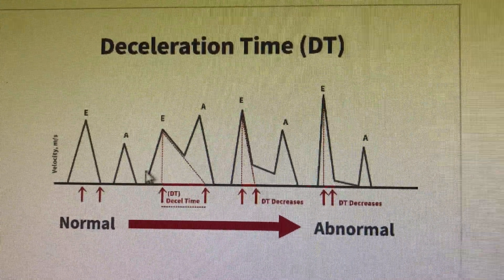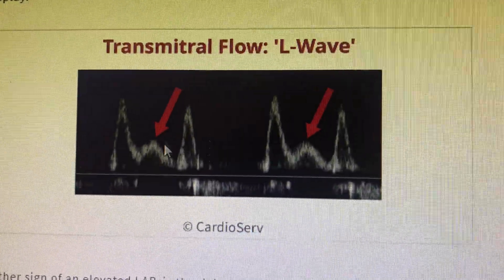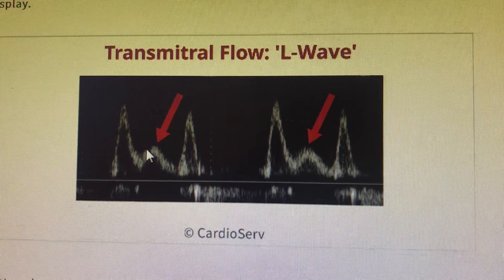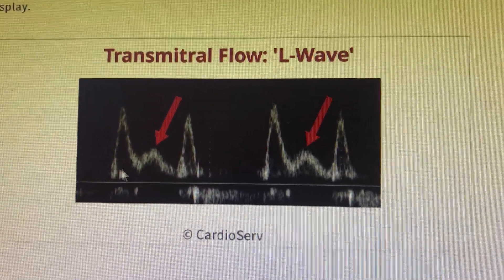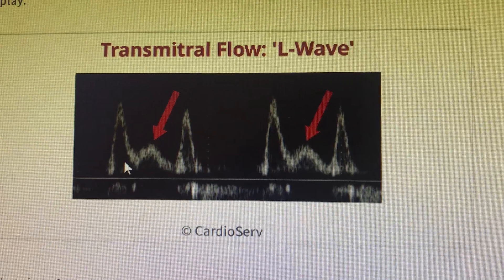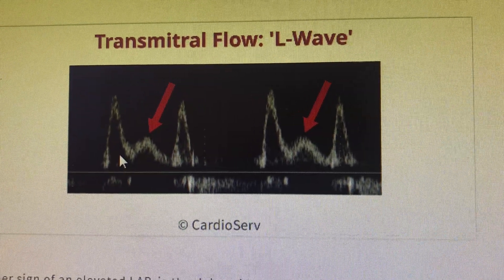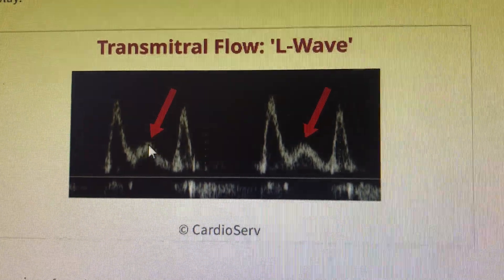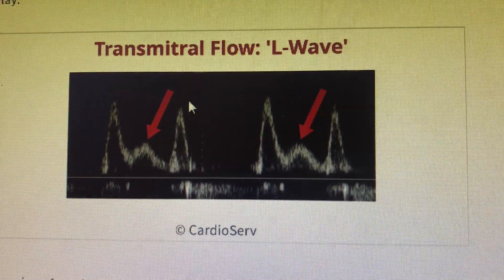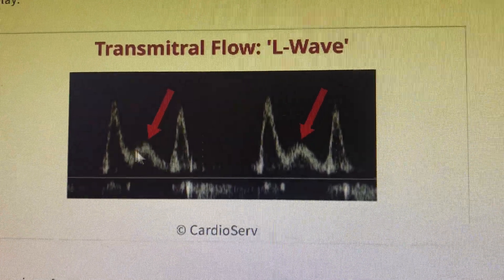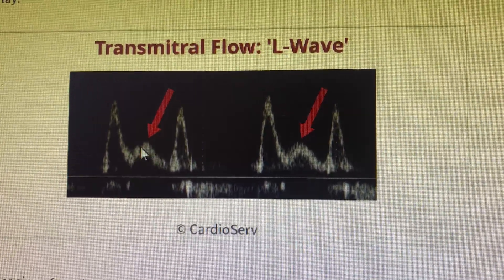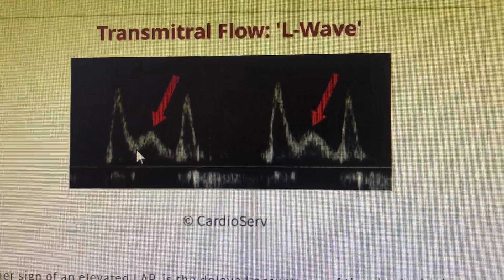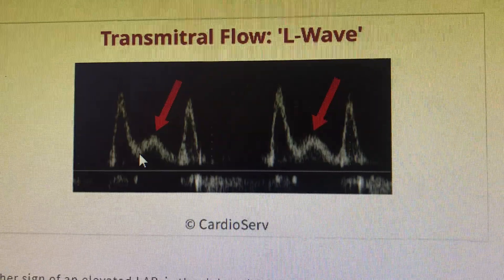It was not present in this particular case. It creates a pseudo mitral stenosis kind of pattern, where the mitral valve has to close before the complete early filling of the ventricles, and then the valve is pushed down and some more blood flows into the ventricle before the atrial kick happens. During diastasis, blood continues to flow in a manner that signifies there is a significantly elevated diastolic LV filling pressure.